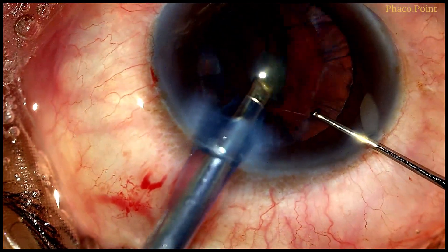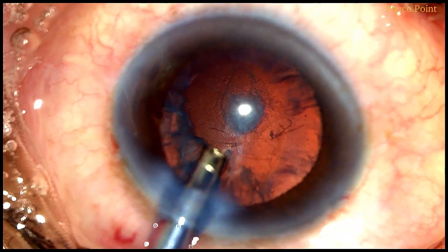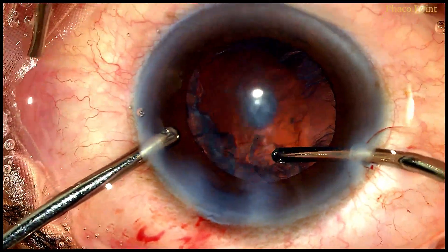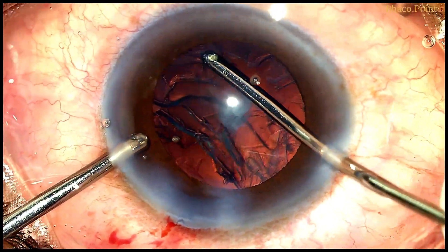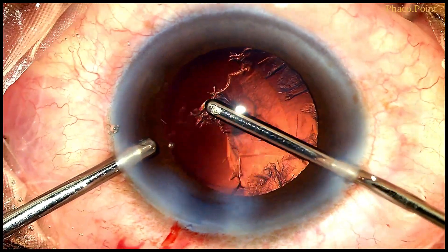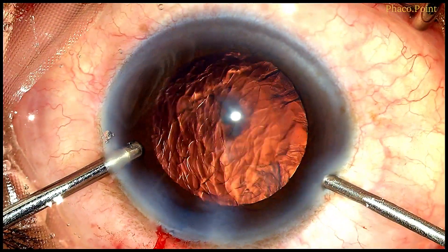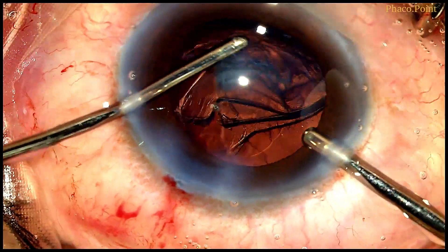With this, we complete the epinucleus removal. Prior to bringing the phaco probe out of the eye, I perform a viscofluid exchange to maintain the anterior chamber. We then proceed to bimanual irrigation-aspiration to remove the cortex. Remember that we have not created a hydrodissection wave here at all — its absence can make cortex removal sometimes a little challenging, so having an oval rhexis may enable us to get the cortex out with even more ease. A viscofluid exchange is performed once again prior to removal of the second half of the cortex.